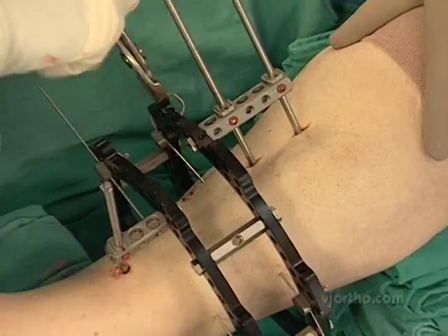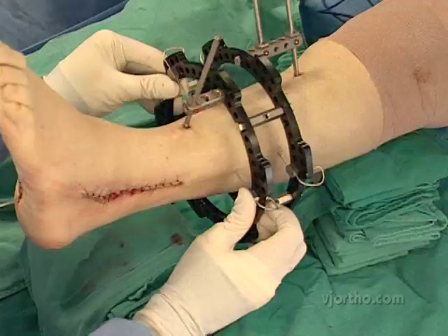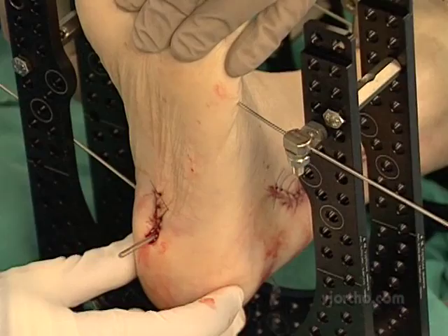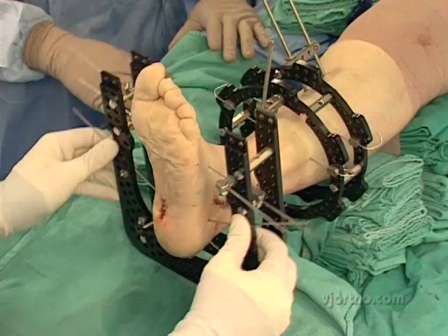Now we have a good proximal ring and everything is just stable. I can work on the foot now and then we'll connect the two. That wire looks fairly straight and it should come across in an area where I can fixate it very well. We haven't even tensioned yet but we have full control of this foot and ankle — I think this alignment looks ideal. I've got this lined up very well with the heel.